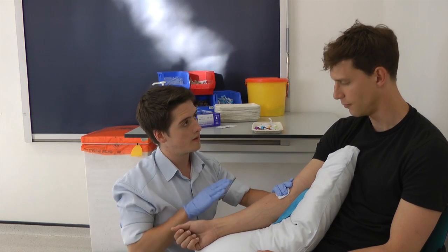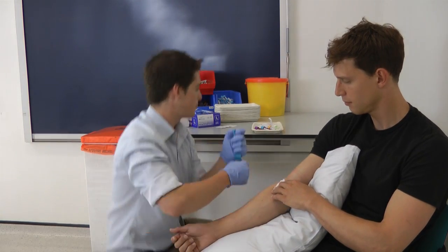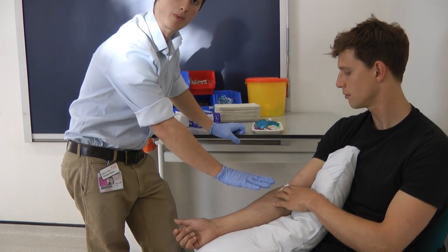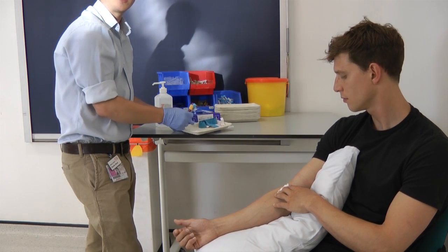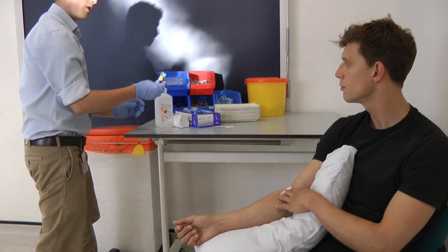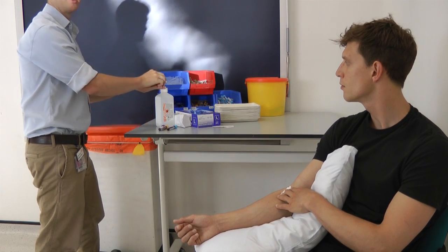Okay, so was that alright? Do you have any questions for me at all about that? No. Would I just be able to get you to hold this down for a second? I'm just going to dispose of some of this equipment. And at this stage, it's good to get some tape to hold down the gauze for the patient. Make sure your vacutainer bottles are properly labelled with the patient's information and also your information. Dispose of your tray, and once these have been properly filed, it's important to remove your gloves and cleanse your hands a final time.